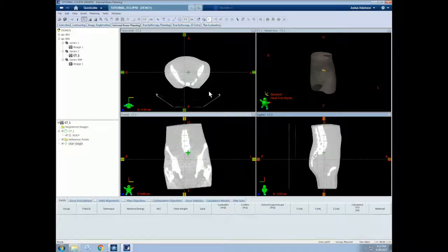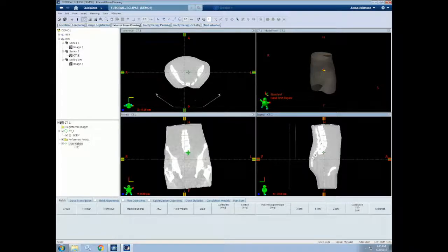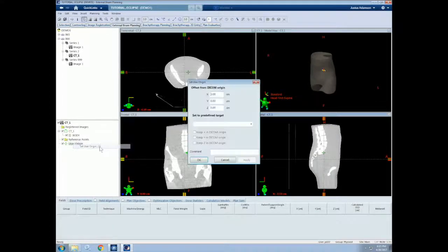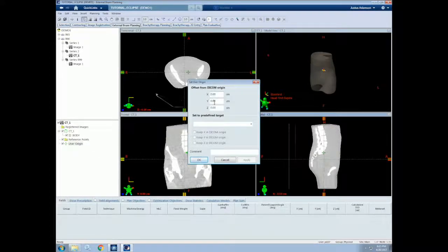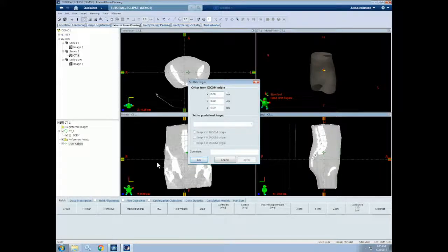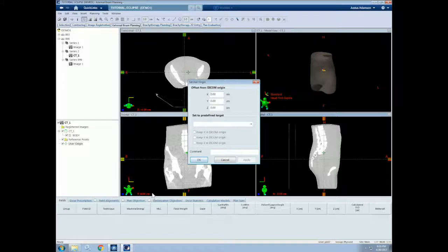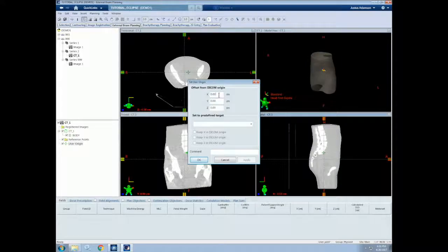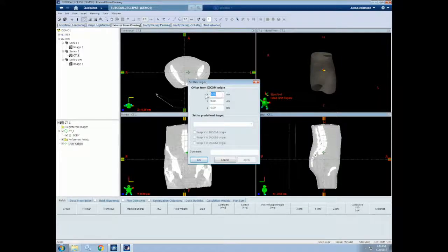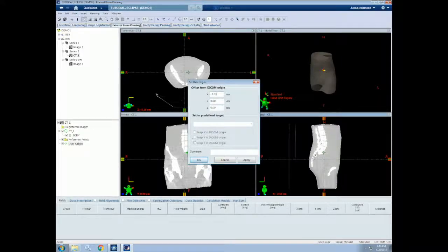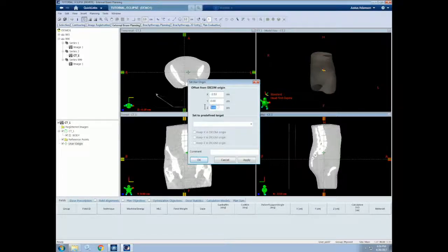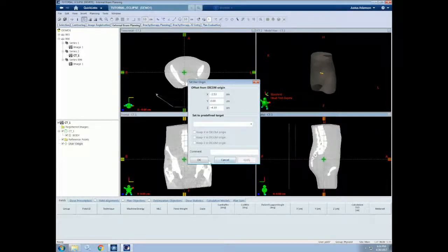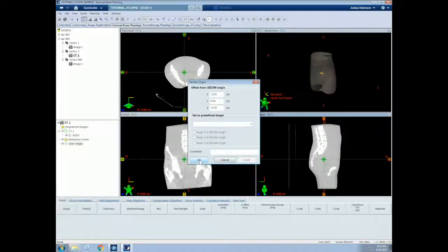Then, we can right click on the user origin and select Set User Origin. Now it allows us to enter three coordinates. The coordinates of our current viewing plane are indicated at the bottom left hand corner of each viewing plane by the red. So let's change those now. Our X coordinate is negative 2.53. Our Y coordinate is still 0. And our Z coordinate is negative 4.19. You can then hit Apply, and our CT0, or CT origin, has been moved.